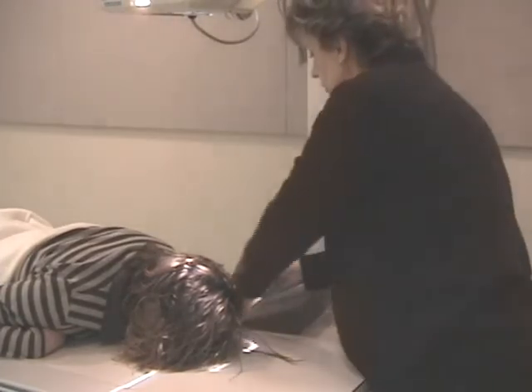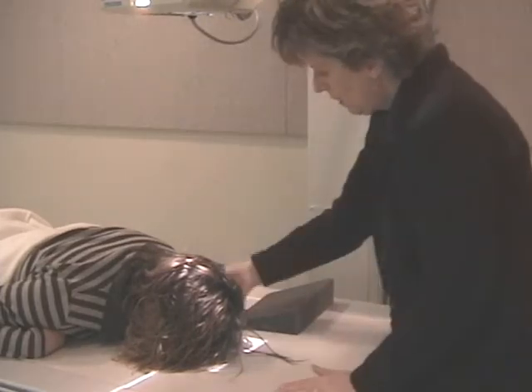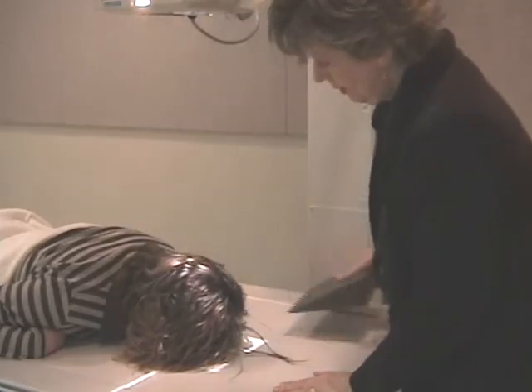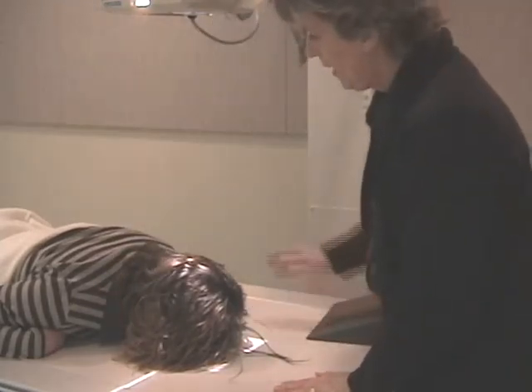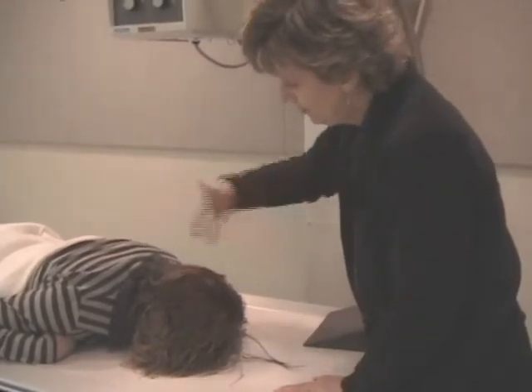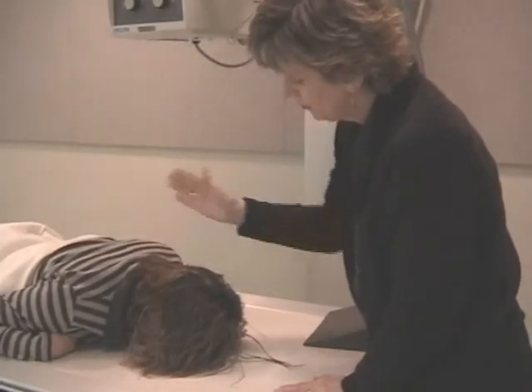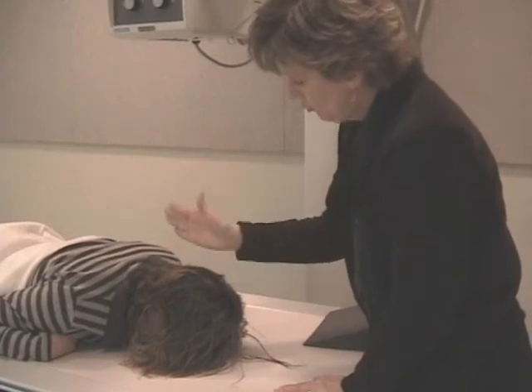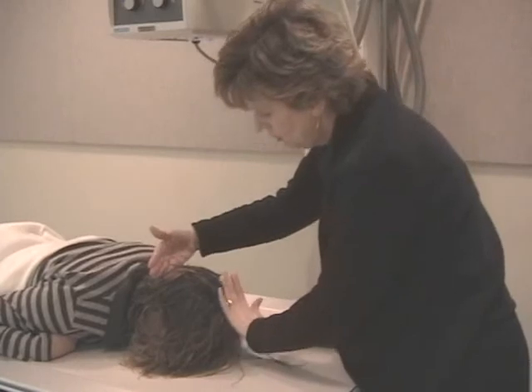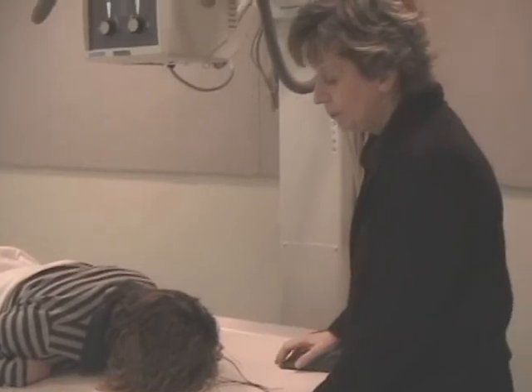And place your marker inside the collimated field, but not into the skull. My marker's over here on the left. I could use a right over here if I wanted to. Again, have the patient's body straight, hands in an equal position, up, down, under the chest, orbital meatal line perpendicular, mid-sagittal plane perpendicular, and then you center the skull. And that would be a PA.